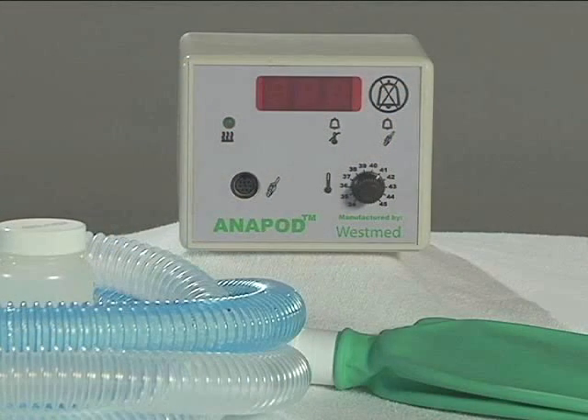The Anapod wick-type anesthesia humidification system of heating and humidifying anesthetic gases to maintain normothermia preoperatively and intraoperatively may be a better, more effective, and cost-efficient method for your surgical patients.